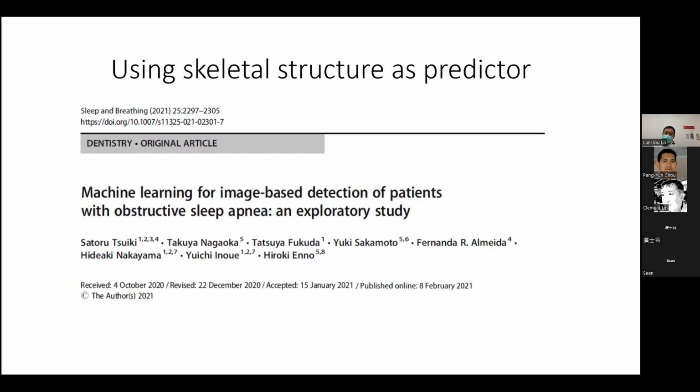So how can we overcome this problem? The big problem is that our reference might have some bias. So some doctors use the whole picture, the whole lateral cephalogram, as the input to feed the computer and let the computer find those important features in the whole lateral cephalogram. So that might help us overcome the reference point, reference line bias problem.